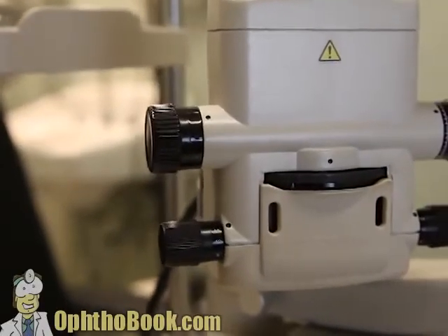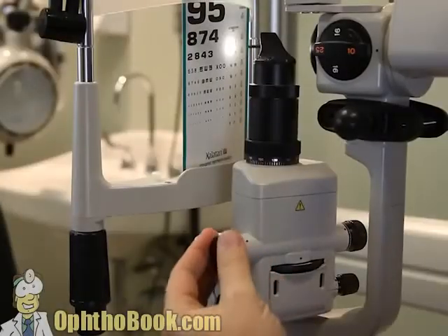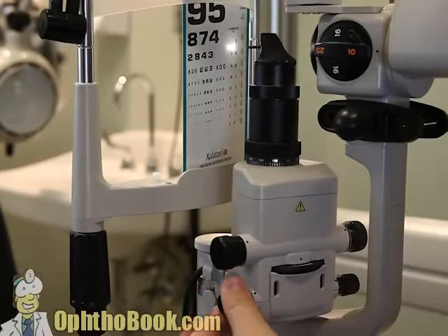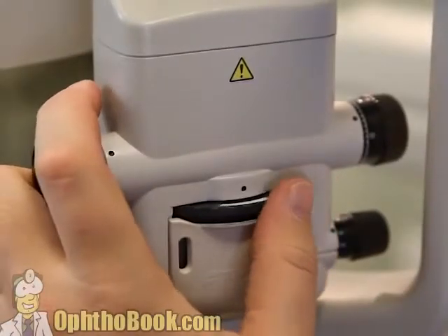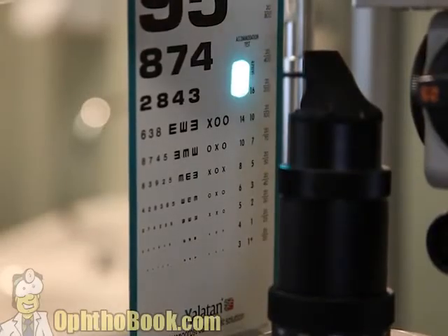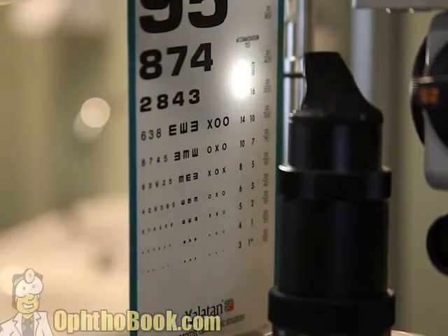We need to familiarize ourselves with the various knobs and dials. These are all in the same place, but one knob controls the width of light, which is probably the most useful control in our entire assembly here. Another one controls the height, not nearly as useful, but it is very helpful when measuring the size of objects. And then we need to find our various filters, and we'll cycle through these as well. We're going to talk about this near the end of this particular lecture. But you can see here we've got green, white, and of course the blue light, which we use most often.